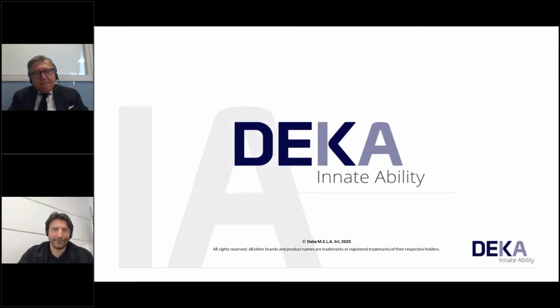Do you have any indications on how long after isotretinoin is stopped can we do the CO2 fractional laser? One month before.